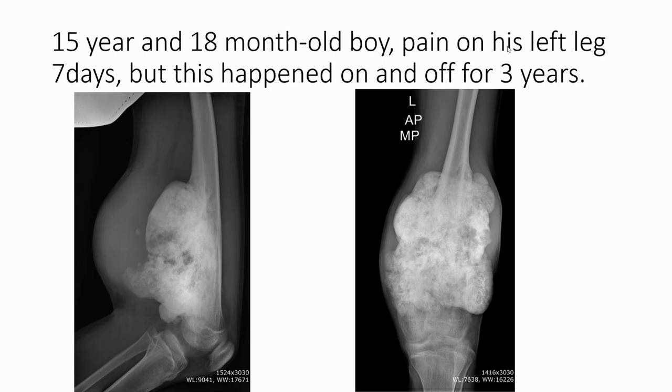So here is a case of a 15 years old boy with pain on his left leg for the last 7 days. This had already happened on and off for around 3 years. So here is his left femoral X-ray, or his left leg.